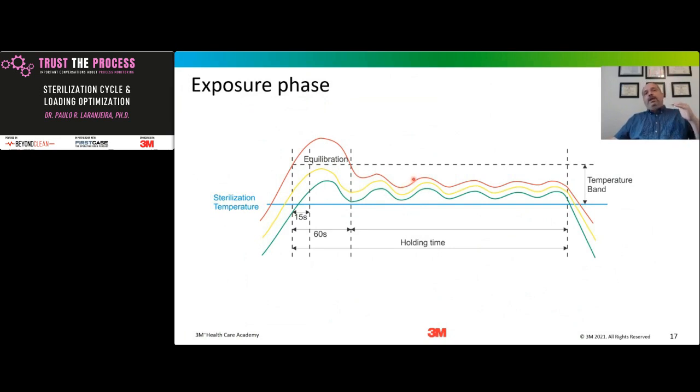So when we condensate, when we have a temperature reduction, that condensation is going to create latent heat, and 80% of the energy used to evaporate the water into steam is going to be transferred to the medical device, inactivating the spores. And this is going to happen many times during the exposure phase until I have reached that 10 to the minus 6, which is the possibility of having one viable spore in the initial population of 1 million. So this exposure phase is fixed.